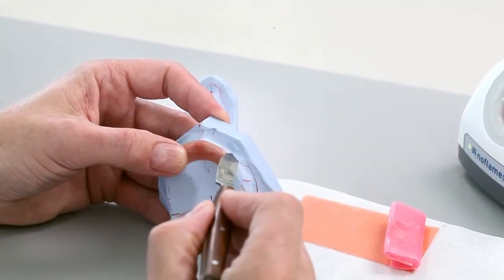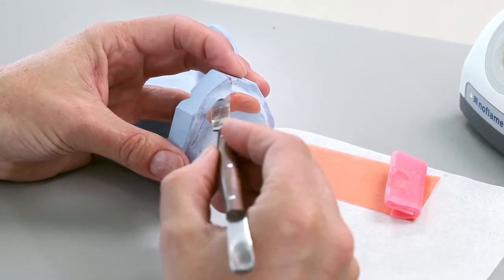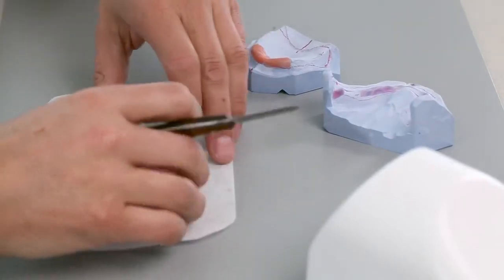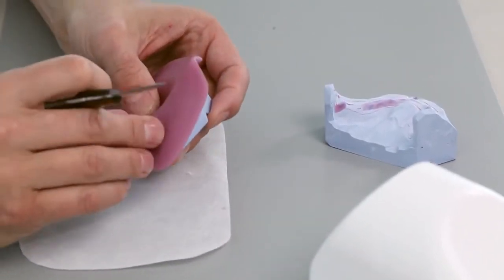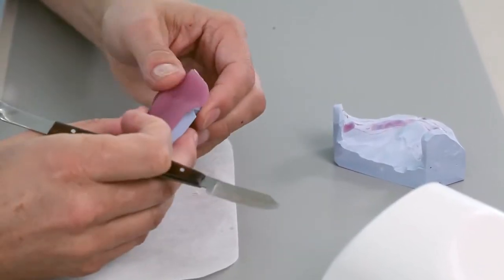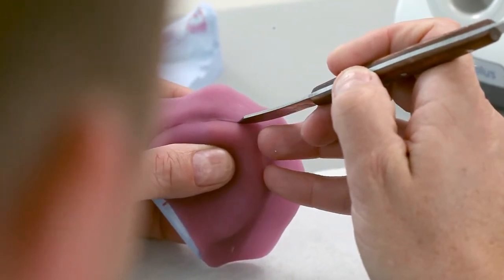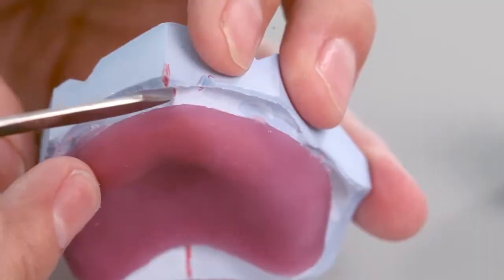The maxillary model can be blocked out with wax in the area of the palatine rugae so that the impression is as detailed as possible. For the custom tray, create an acrylic base within the maximum tray extension line. It is important to keep the movable mucous membrane unobstructed for the myodynamic expansion.